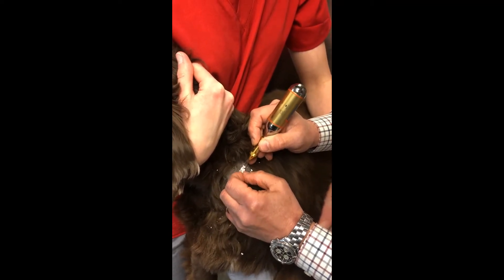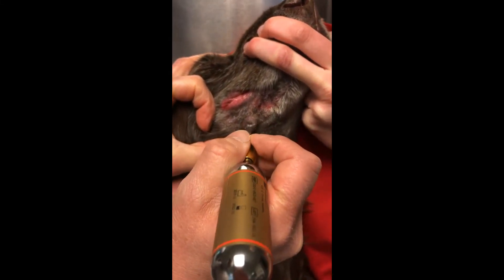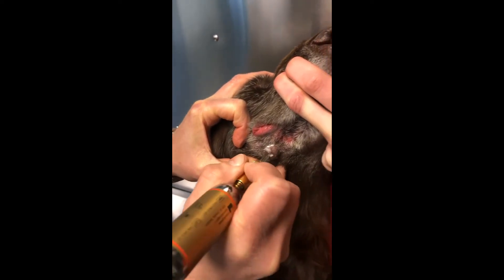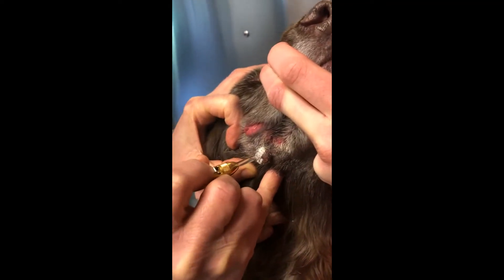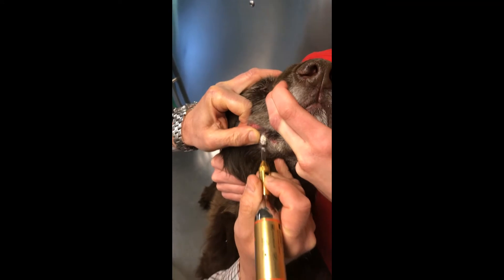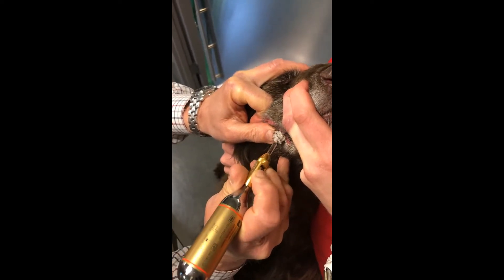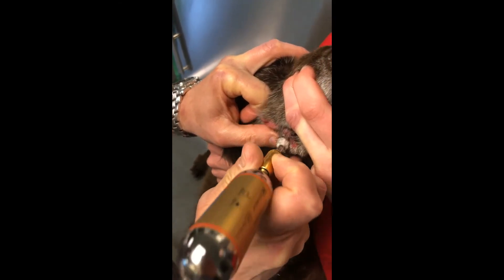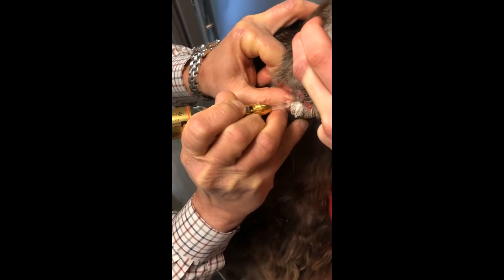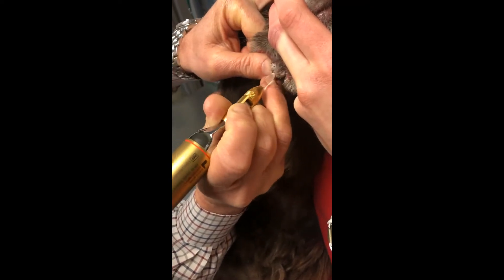Once the mass is completely frozen we'll go through a thaw cycle. Given the large size of this mass we're going to use the D3 tip, and again we're going to freeze the entire mass — working on approximately 50% of the mass at a time because of the size — then we'll move to the other side. We're running out of gas.